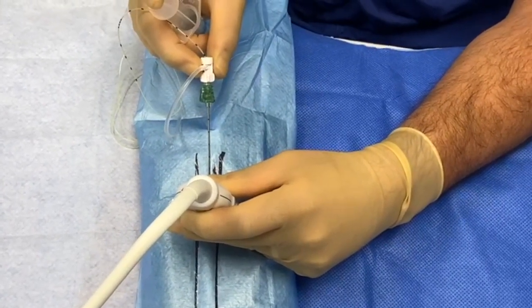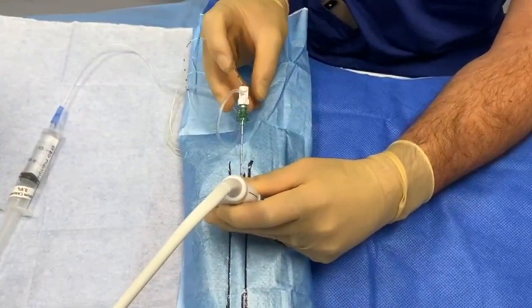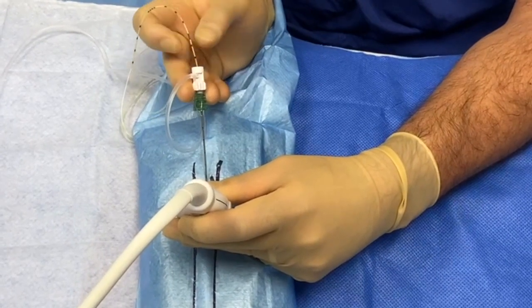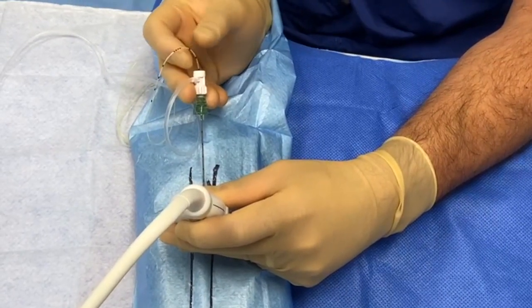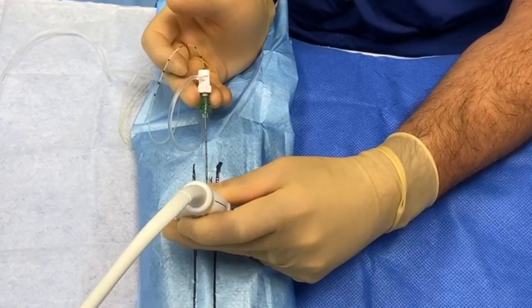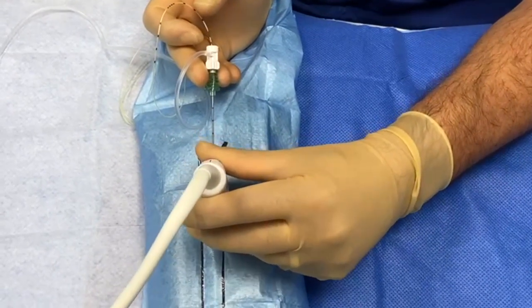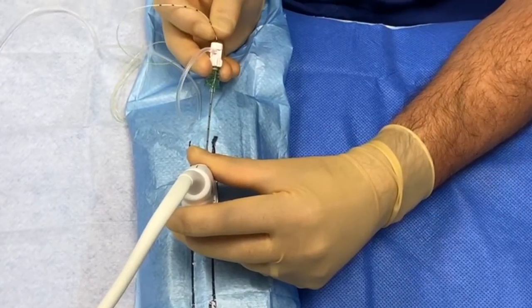At this point I've got a couple of options. Number one, I can gently relax the needle because it shouldn't move, put the syringe to one side, then re-grasp the needle making sure I'm happy with seeing it on the screen. Because I've pre-loaded the catheter, I can simply advance it using my thumb and index finger while supporting the needle between my middle finger and ring finger — a relatively nice technique. The other option is, while I've got a transverse view of the nerve, I can rotate the probe through 90 degrees and scan along the shaft of the needle, potentially watching the catheter emerge from the tip in real time.